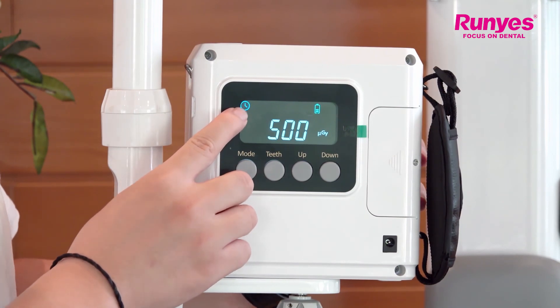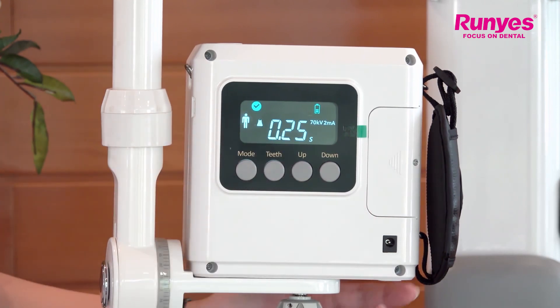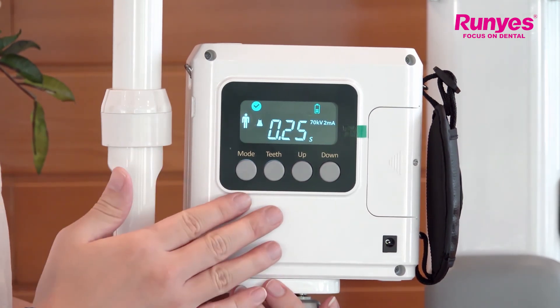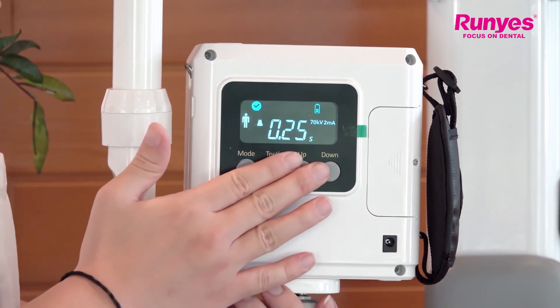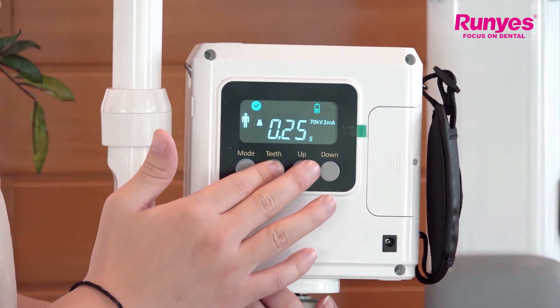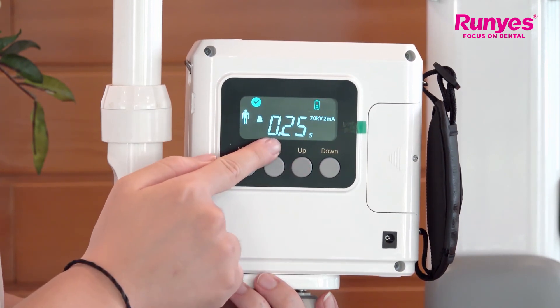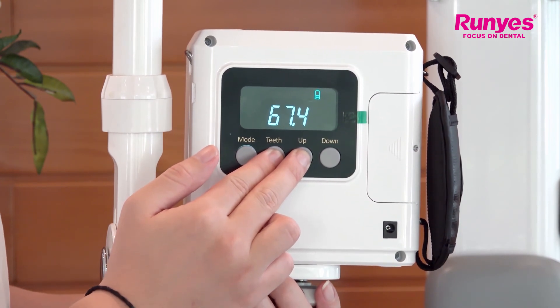This icon showing up indicates that the tube is under cooling. The exposure is finished. After the exposure is finished, we can check the kV value and the current value of the current exposure. To check the voltage of the last exposure, you can press the teeth key and the up key together. Here is the voltage of the last exposure.